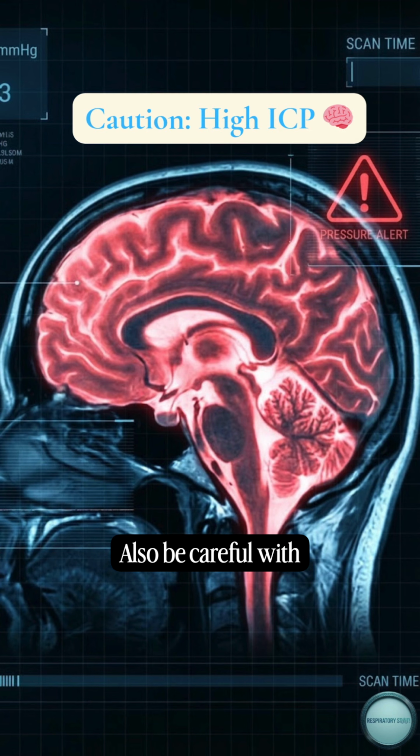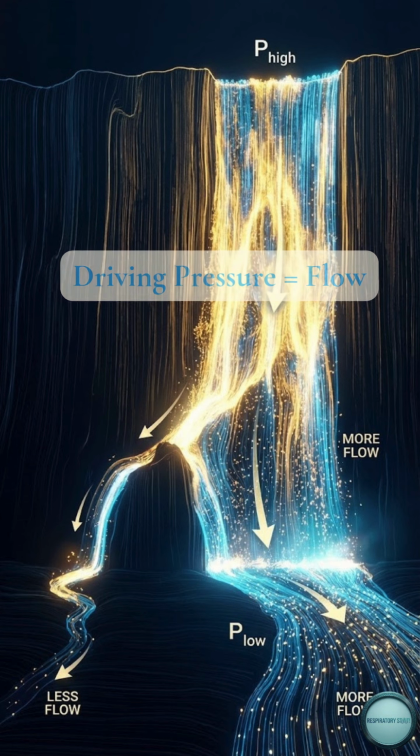Also, be careful with head traumas. The high mean airway pressure can reduce venous return from the head, which increases intracranial pressure. If the ICP is high, APRV is usually a no-go.